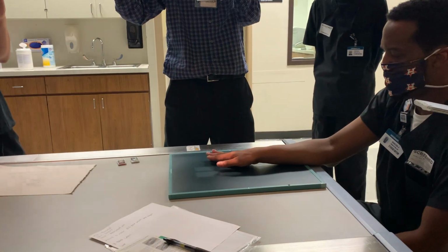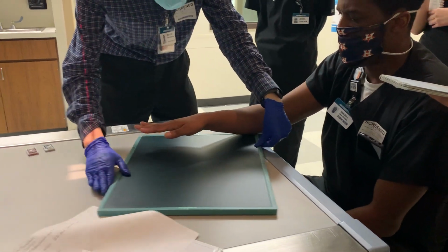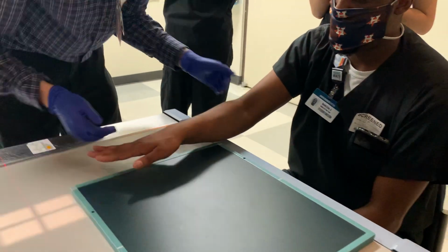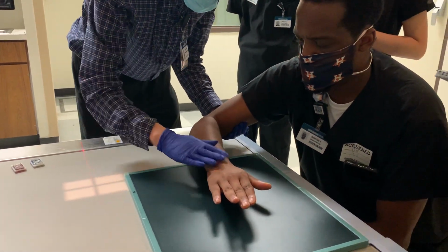10 to 15 degrees. If, as an example, I'm going to take this board and turn it quickly. Okay. I want you to lean forwards, bend your arm 90 degrees. Okay, down.